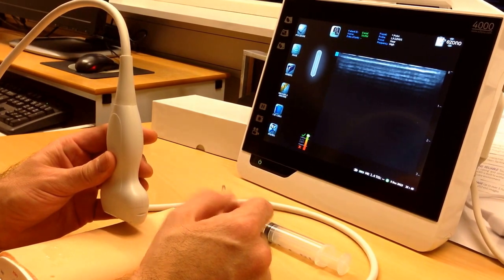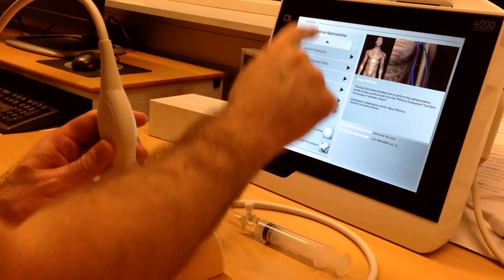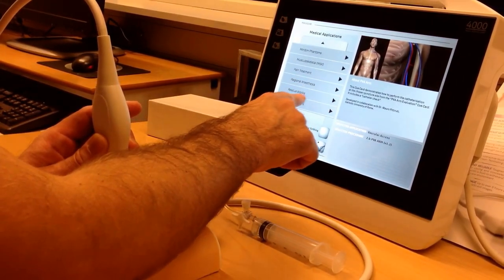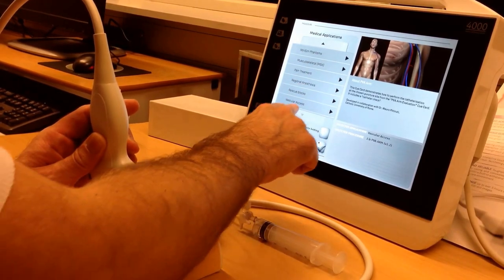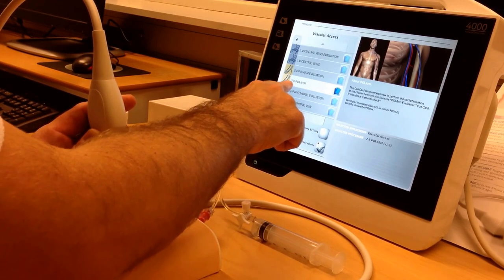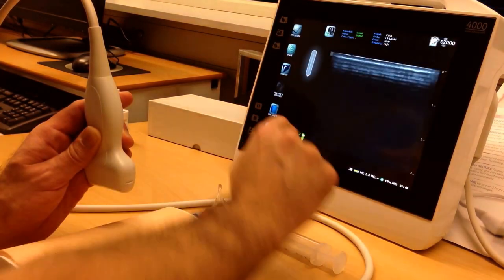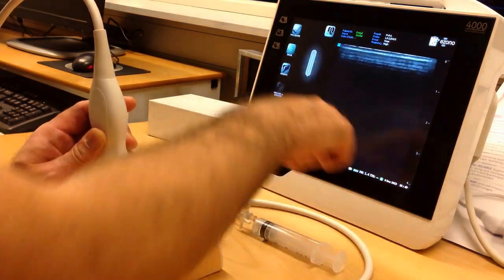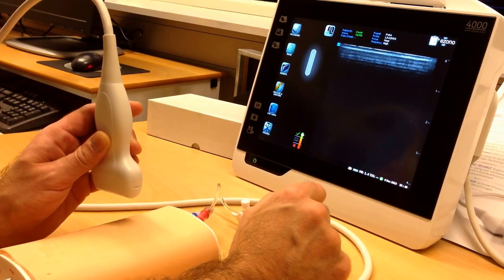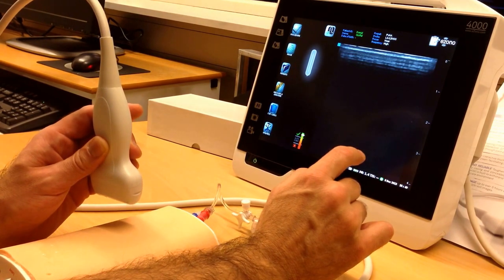First thing you want to do — if you want to do vascular access, for example — you choose the procedure. Here you can go into regional anesthesia, rescue blocks, vascular access, and lots of different things. I want to do vascular access right now, specifically peripheral vascular access of the arm. I choose this one here and automatically the whole screen setup is going to be done in a way that's supposed to be perfect for doing vascular access of the arm.